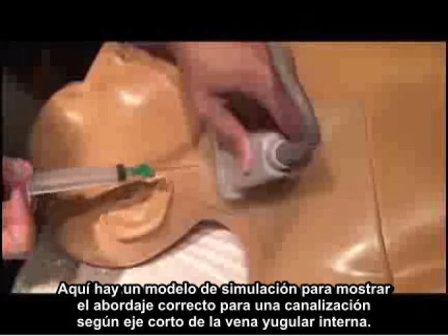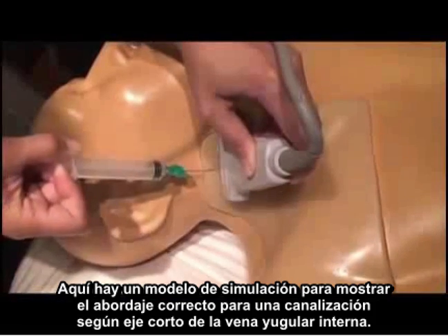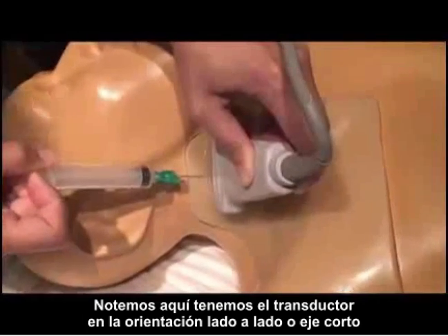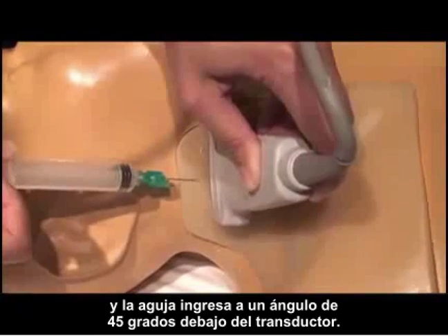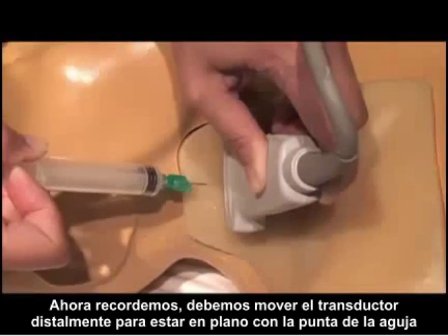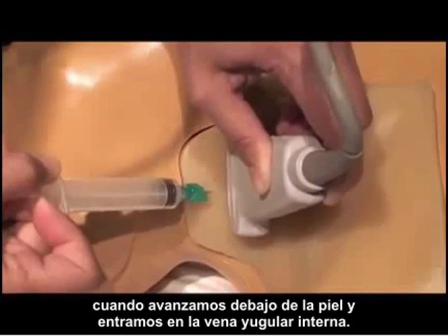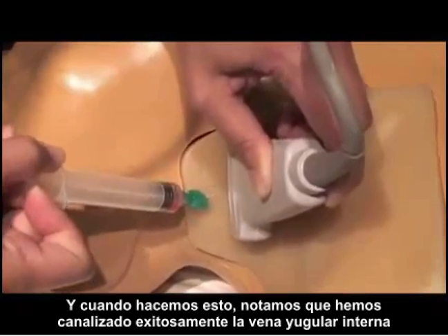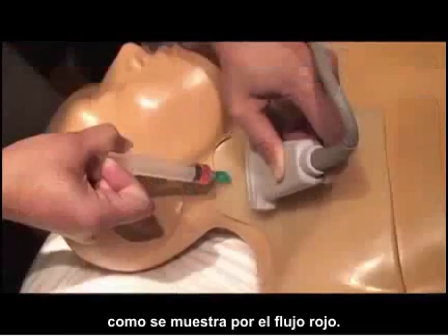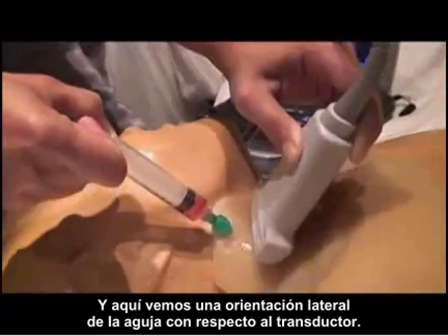Here we use a simulation model to show the correct approach for a short axis cannulation of the internal jugular vein. Notice the probe is in a side-to-side or short axis orientation and the needle is coming in at a 45 degree angle underneath the probe. We must move the probe distally to stay in plane with the needle tip as we advance it underneath the skin and into the internal jugular vein. As we do that, we notice we've successfully cannulated the internal jugular vein as shown by the red flow of blood.